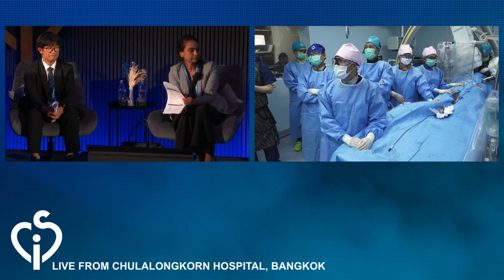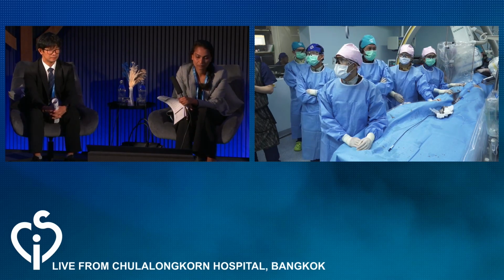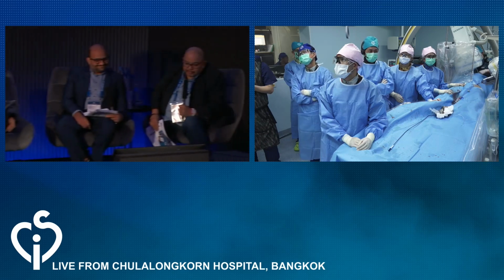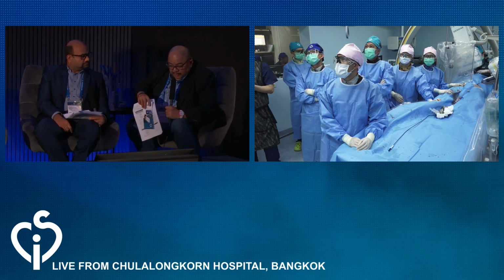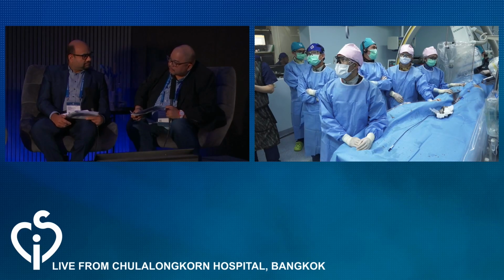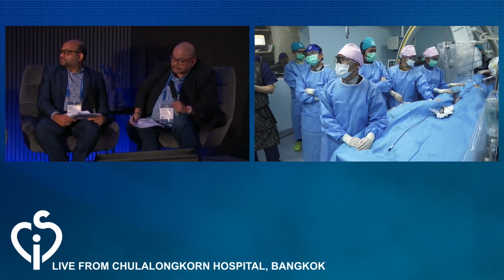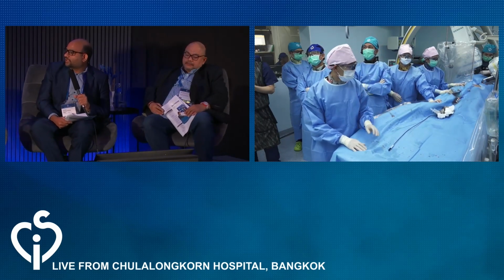Okay, Jean Antonio? I would close it, and I would remeasure it once the delivery sheath is already on the defect. After I remeasure it, I would probably go with a 6.4 or 7.5 multifunctional occluder. Right, MFO. Sanjeev? I'll go with a single disc device, ADO1.